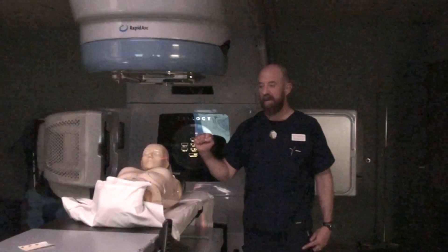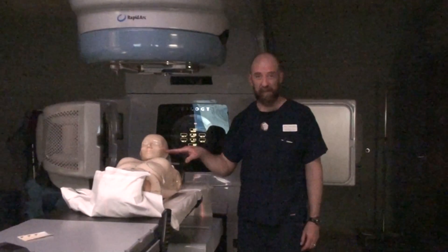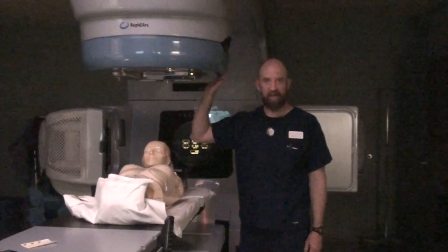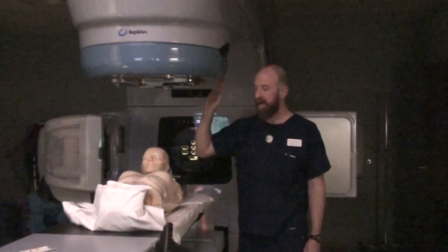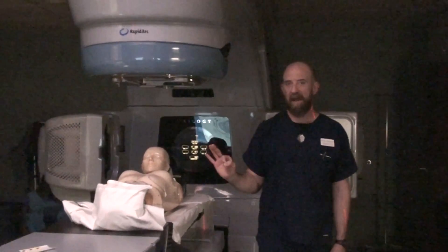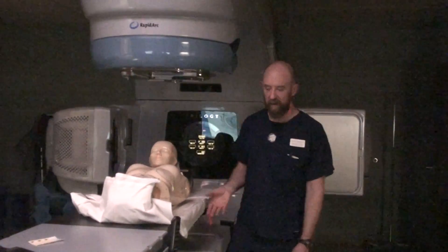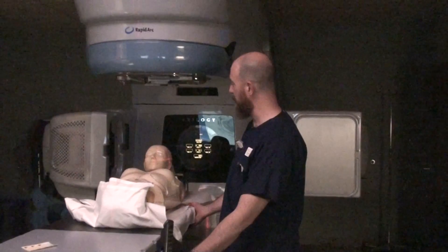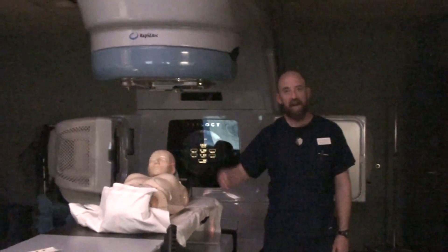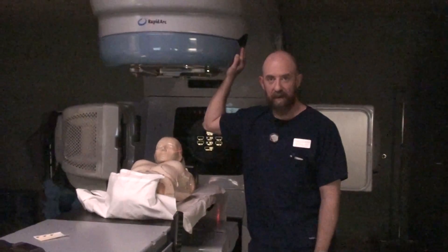You have already notated the part that was skipped. Once the doctor fluoros and likes everything, notate everything: collimator, gantry, field size, and table. Once you've got those table settings set, leave the lateral table setting off because you still don't know what it is. That lateral is going to change once the doctor looks at fluoro from the anterior.